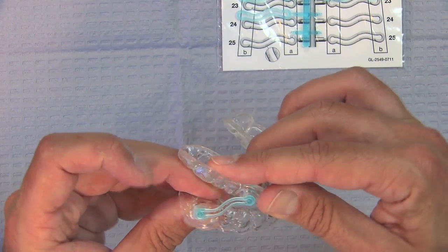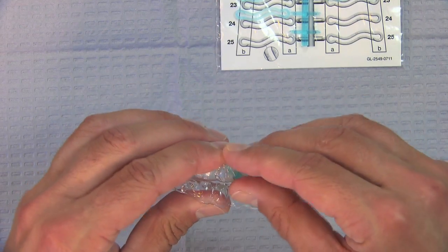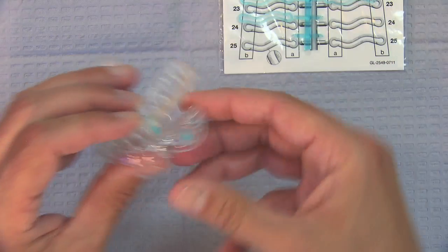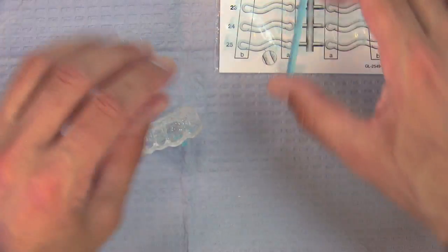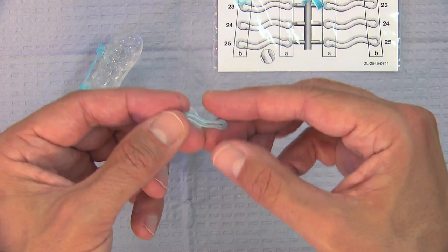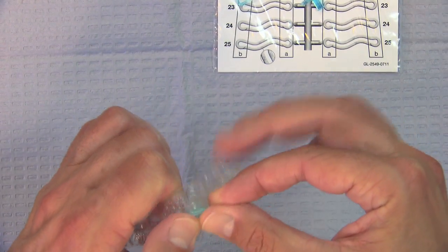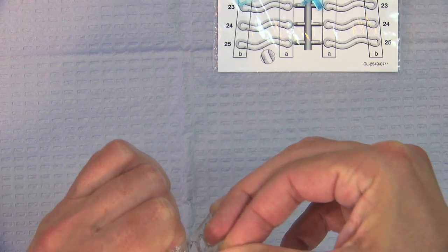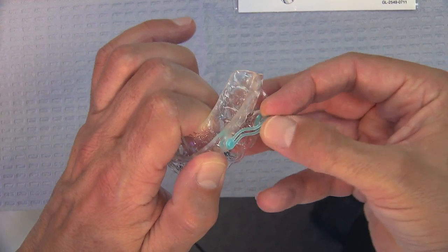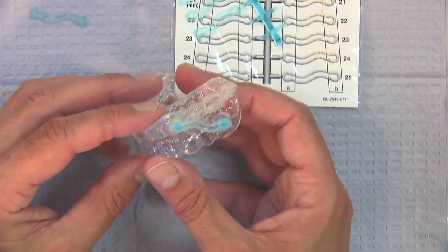And they're going to slide the lower one in just like that. Then on the other side, do the same thing. Patient takes off both of these. Takes off the 24 millimeter, the 1 millimeter shorter strap, which is going to bring the jaw forward more and might be just the right amount of anteriorization to stop the patient snoring. And click those two on.